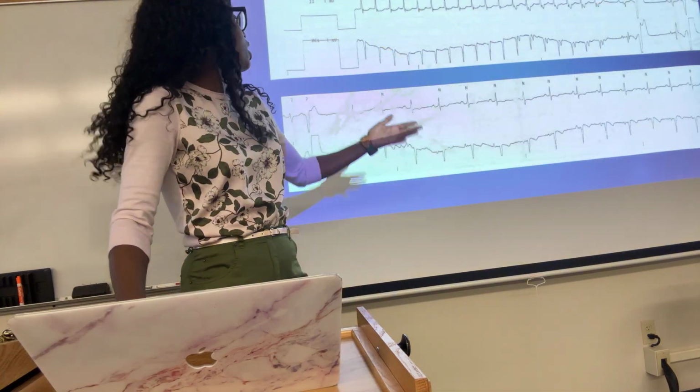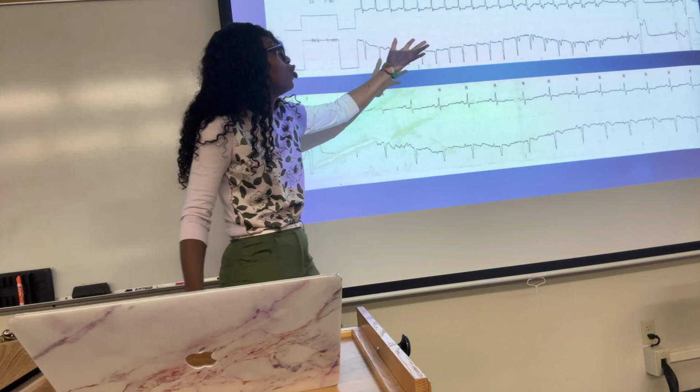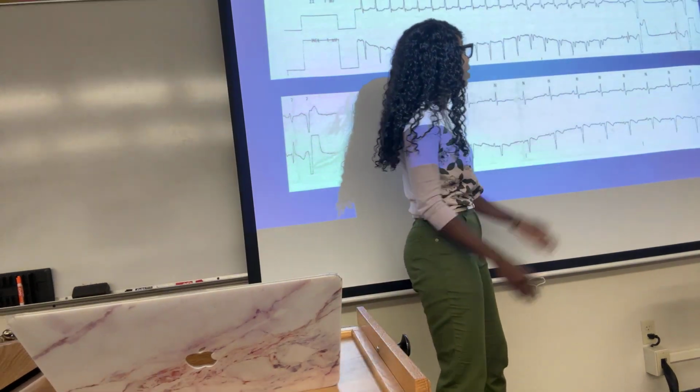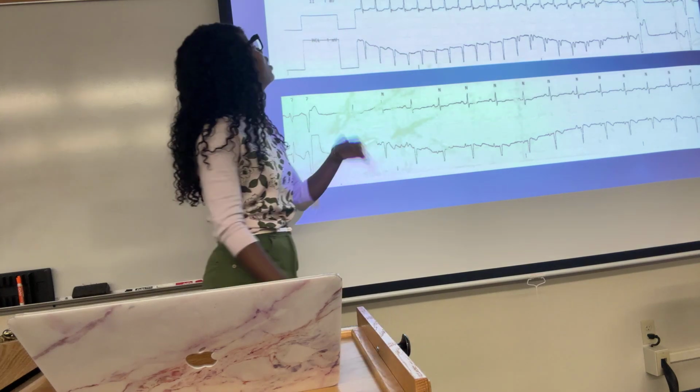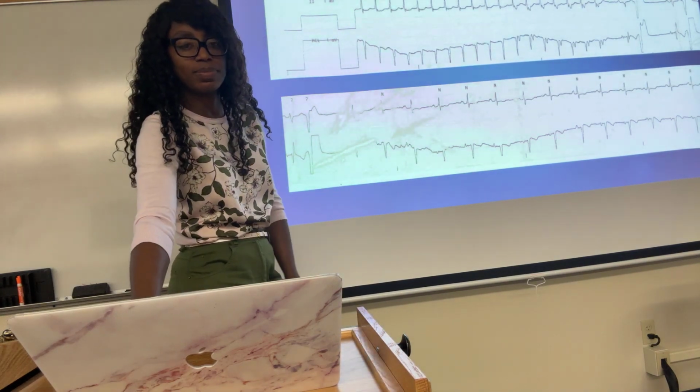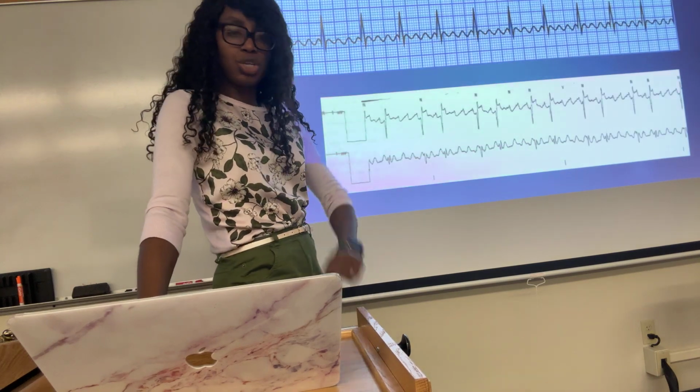All right, so here's an example of what I was saying, how it doesn't look cute. It's not very structured and clean, right? So this is a PAT with adenosine that they were given. Now we are into atrial flutter.